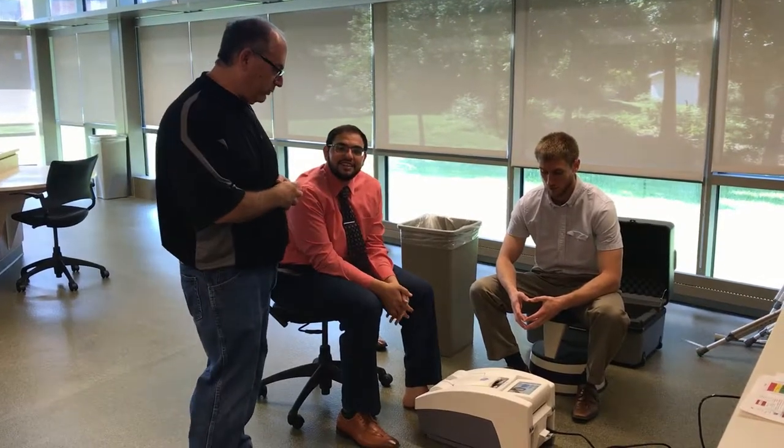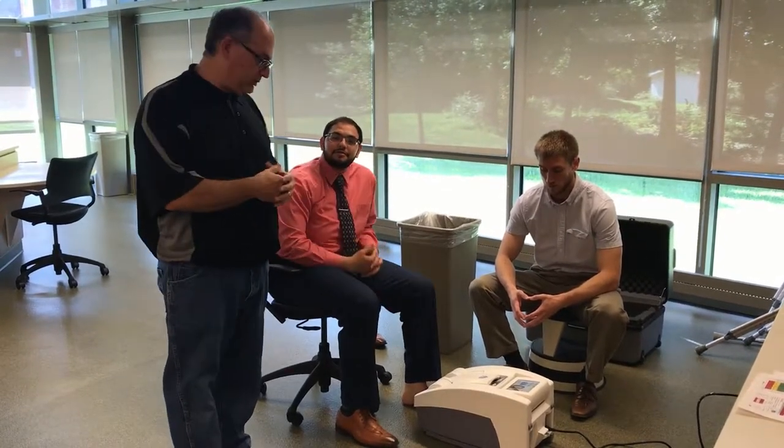Welcome. We're going to start with how to run a test procedure. But before we do that, we're going to have to start with the QA process.